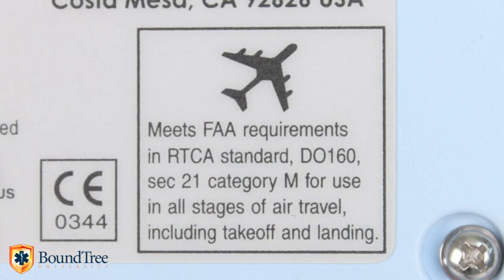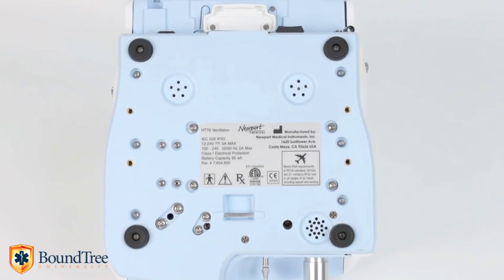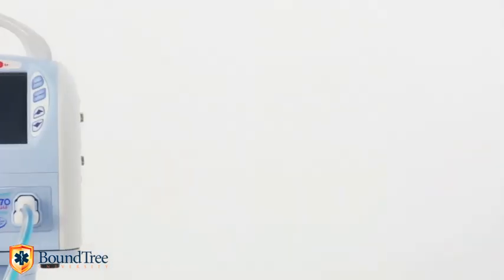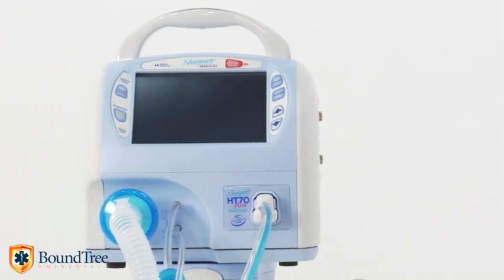The label you need to show when taking it on board a commercial flight is located on the bottom of the ventilator. This adaptable little ventilator is very easy to set up for either invasive or non-invasive applications. Just be sure to use a mask that is non-vented when setting it up for BiPAP non-invasive style of ventilation.